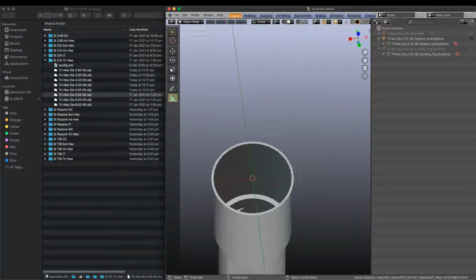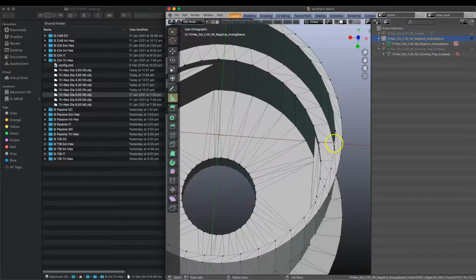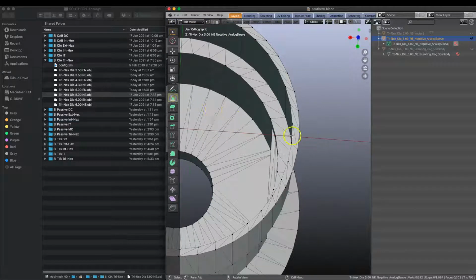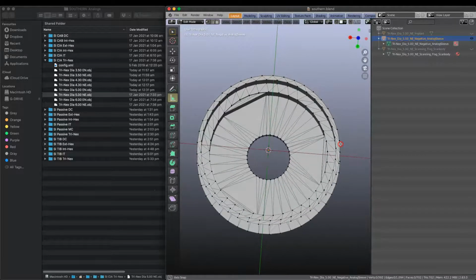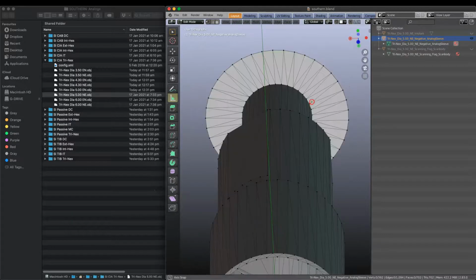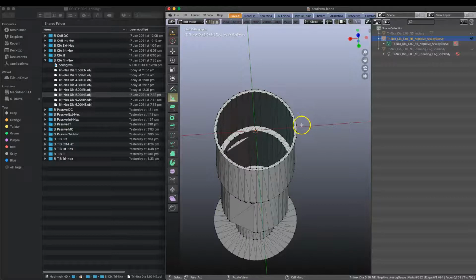If we measure this little ledge that they've provided here, we will see that in edit mode, tab into edit mode, I'll be able to take a measuring ruler here, and from the one side to the other we'll get to maybe 0.15. I'm going to be adding, say, 0.55 onto that, and then we'll have our wall thickness of 0.7. You can see that the top part of the component is aligned with the bottom base plate here. This is kind of a plateau, and they sort of match together. So if I'm going to extrude this edge loop outwards by 0.55, and we do likewise with the lower one, we'll be able to get the top as a 0.7 wall thickness, which is what we want.